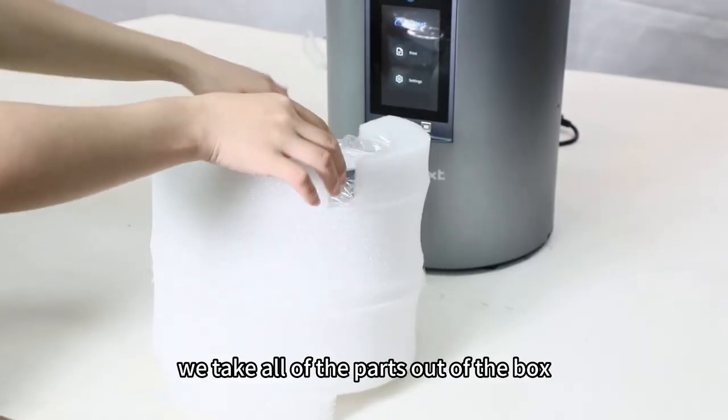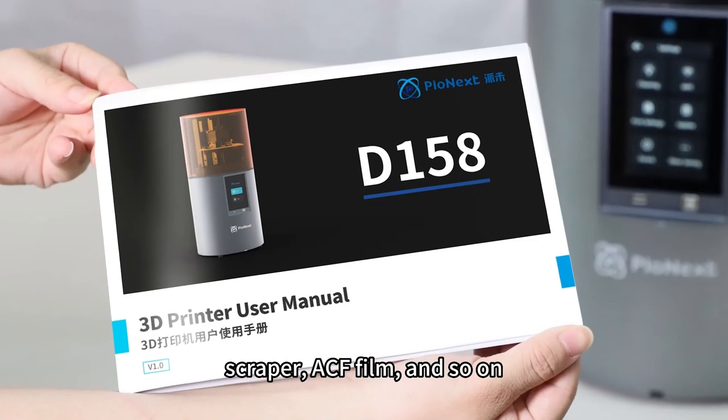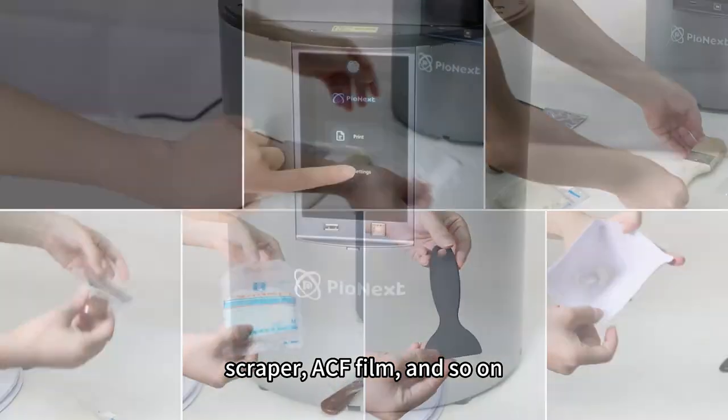And then we take all of the parts out of the box, including calibration cards, scrapper, ACF film, and so on.